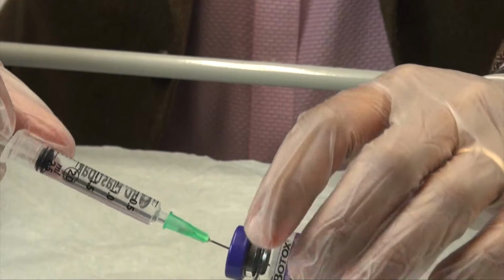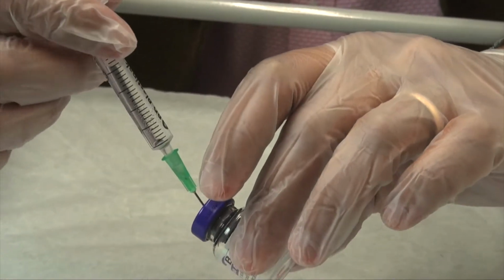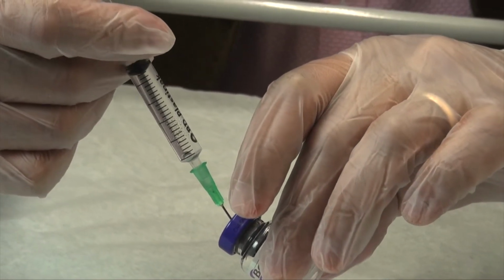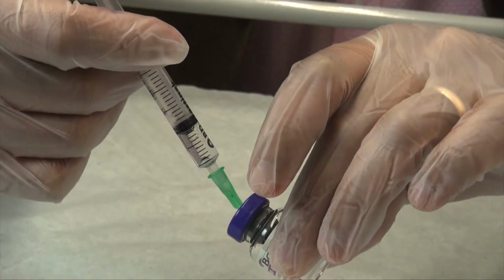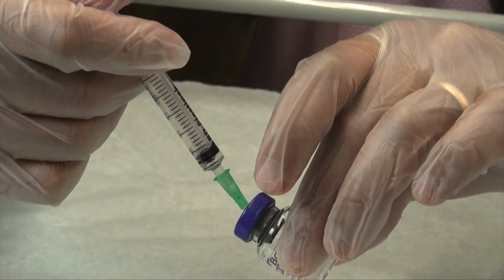There we go. And place the needle against the edge of the glass vial and gently and in a controlled fashion run the saline into the vial.